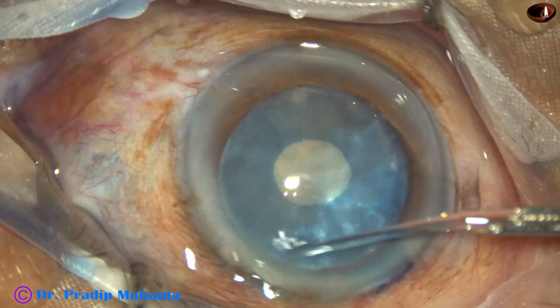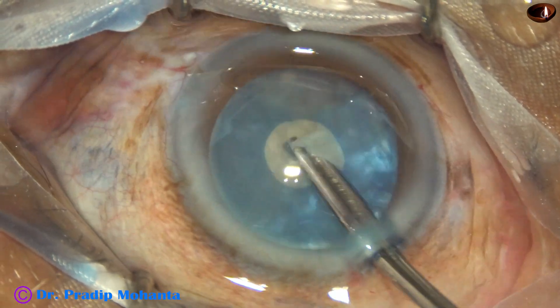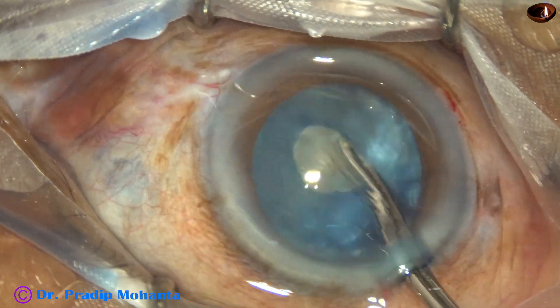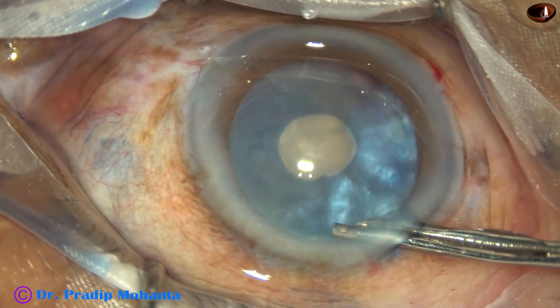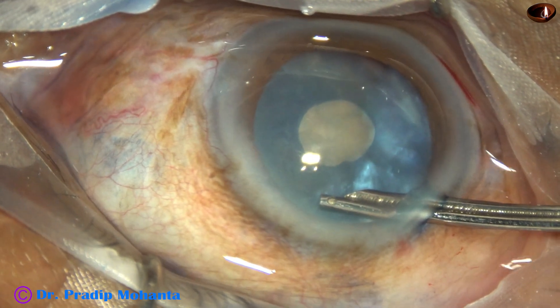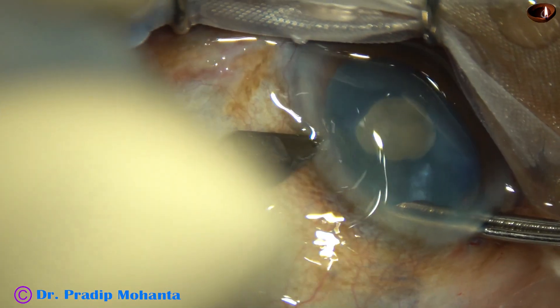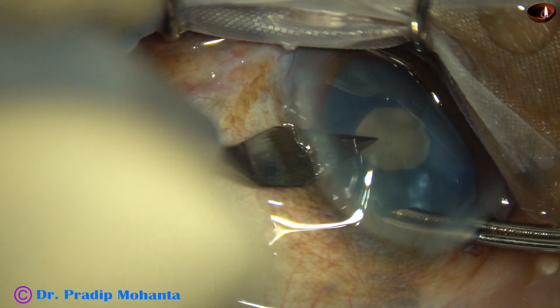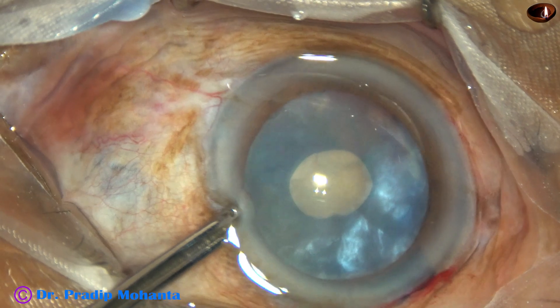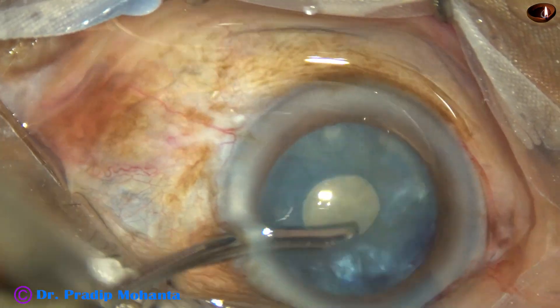And now we can see that the part just in front of the main wound has a lot of cortex, and that part of the capsule is elevated. We must not try enlarging the rhexis at this moment. The sideport on the left side was not made, so I make the sideport on the left side and aspirate the cortex from this area.